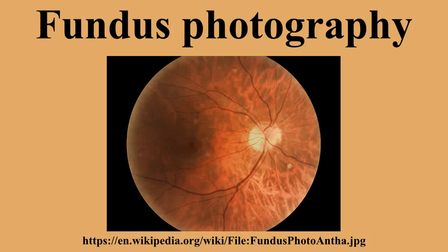Fundus photography is mainly used to monitor the progression of a retinal or optic nerve head disorder. It is also good for providing photo documentation for the continuum of care and to monitor the patient's ocular condition.